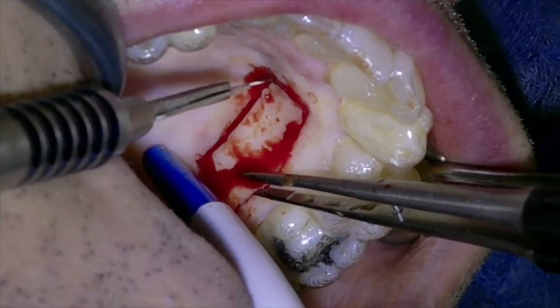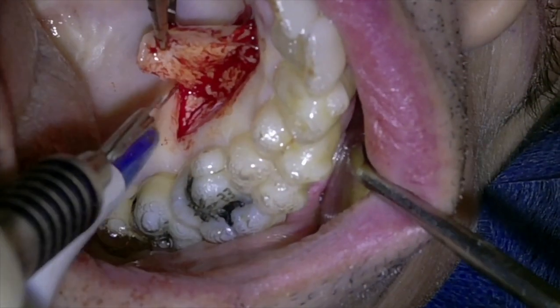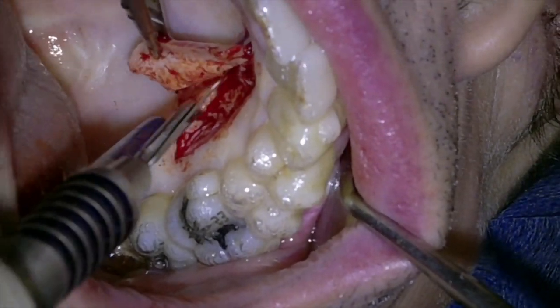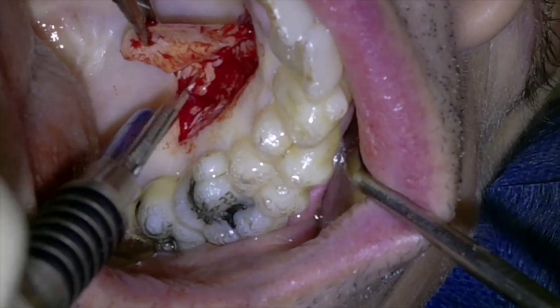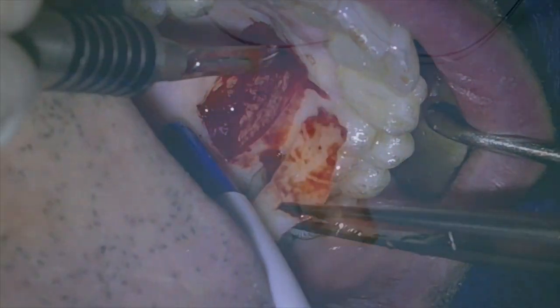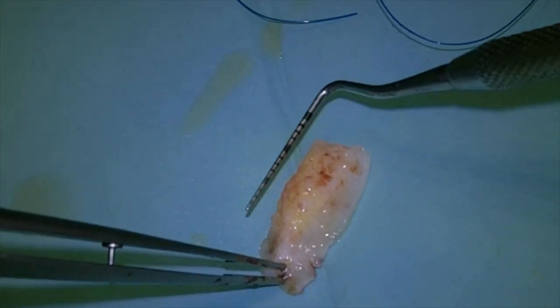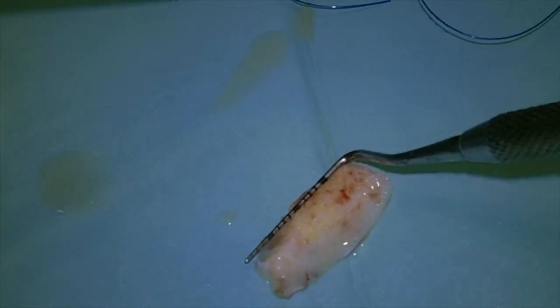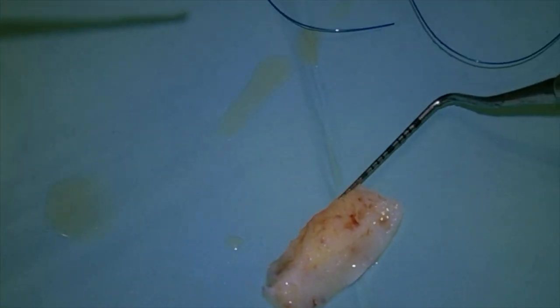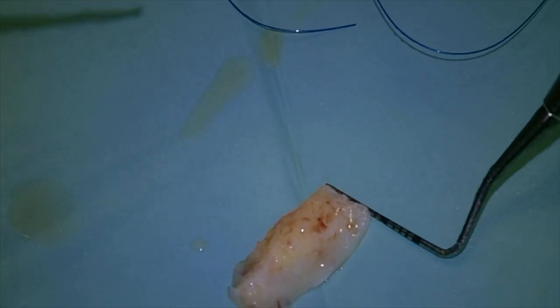Once I already know that it is fully detached, I'm finishing with my last incision, which is going to be at the most apical aspect. Have in mind that you don't want to go too apical, you don't want to block those blood vessels, and at some point that free gingival graft is going to come. As you can see, right now what we have is a piece of epithelium, connective tissue, and fatty tissue.